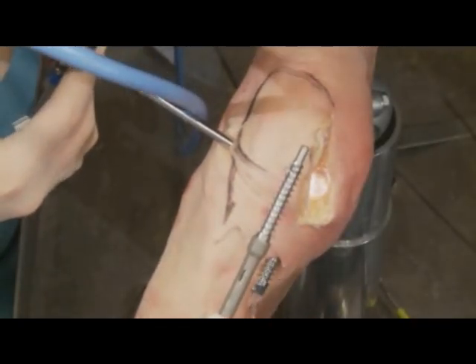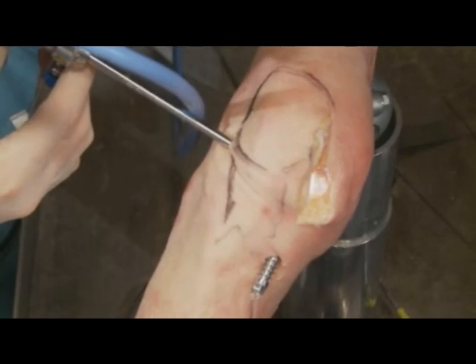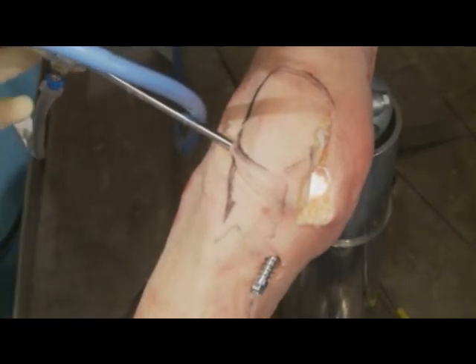So now all that's left to do is to put in our cutting device, and we're going to cut a slot for our tibial implant.